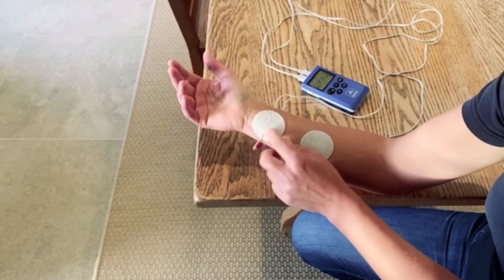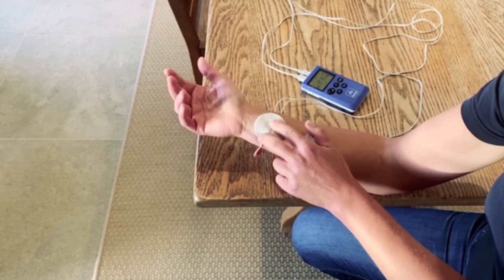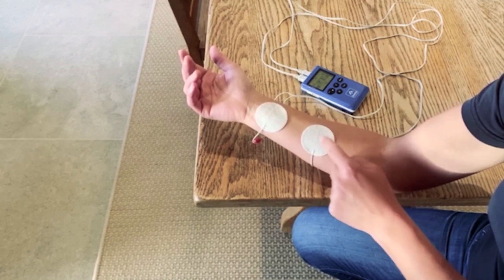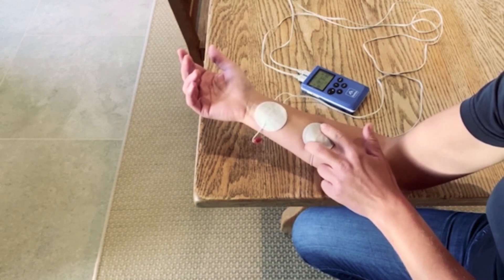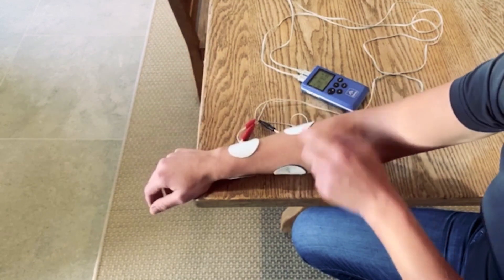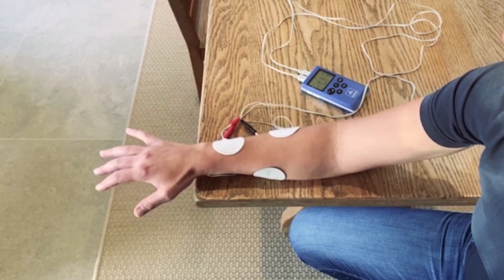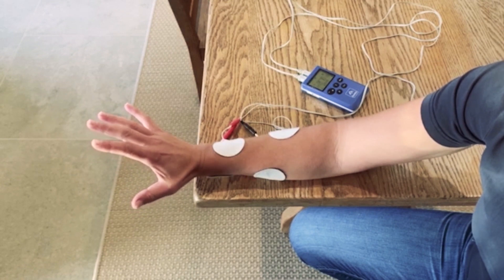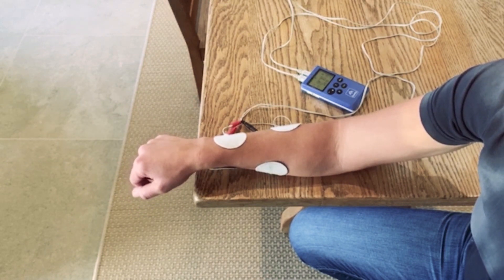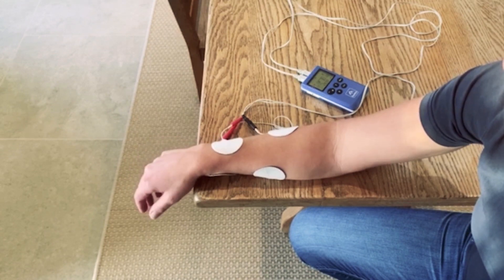Then Channel B: one electrode over the flexor tendinous part and one electrode at mid-forearm, picking up the wrist and finger flexors. So Channel A comes in for wrist and finger extension, then a rest period, then Channel B comes in for wrist and finger flexion.